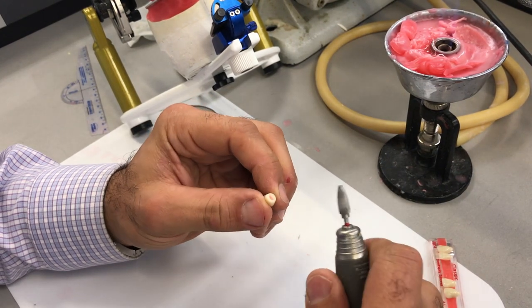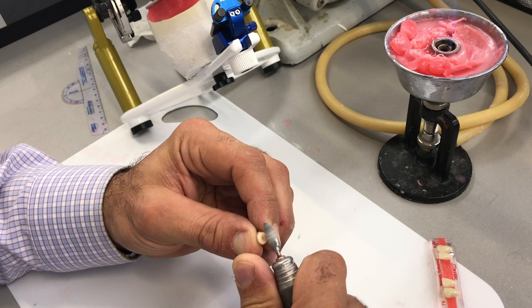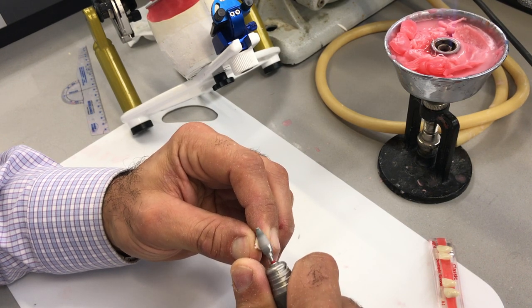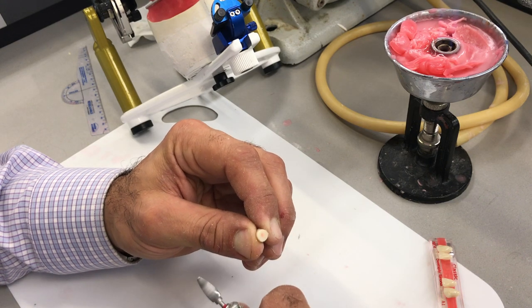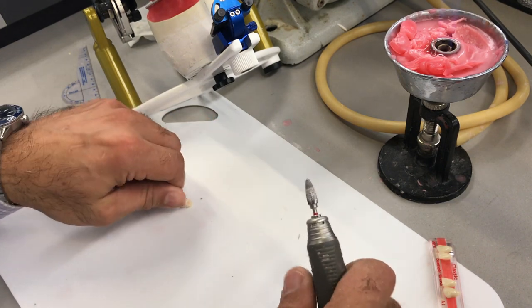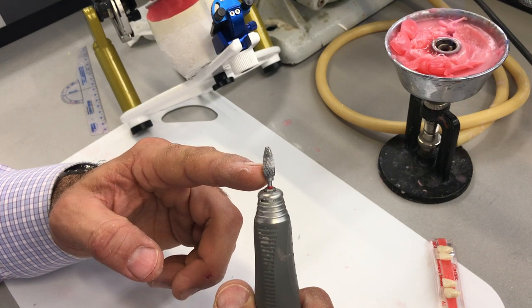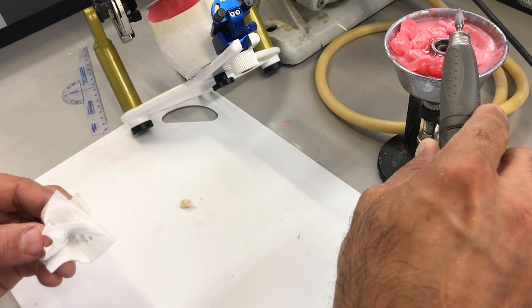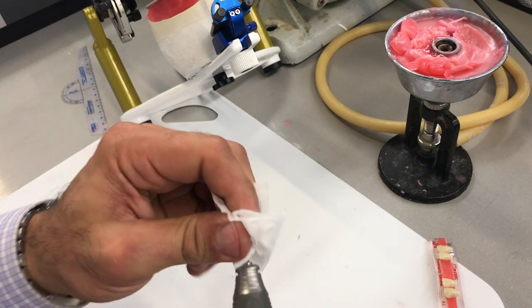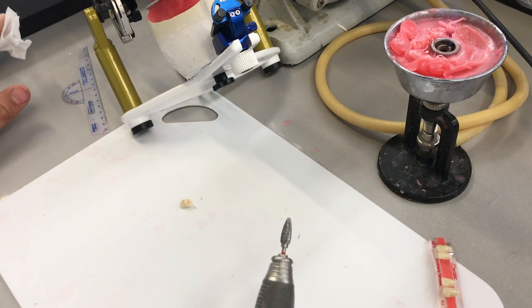I can use my handpiece, hold the tooth rather firmly, and reduce it just like that. If you don't wipe the wax off the back of the tooth, it'll clog up your burr. So I'm just going to hold my burr ever so slightly over the Bunsen burner and wipe that off, so I can cut through the tooth a little bit better.